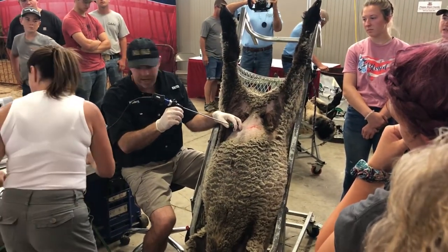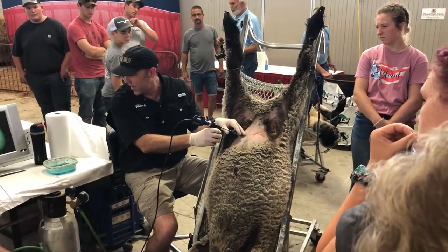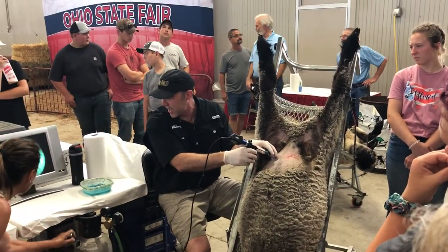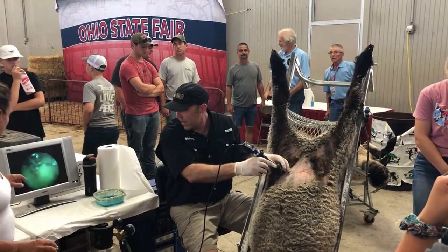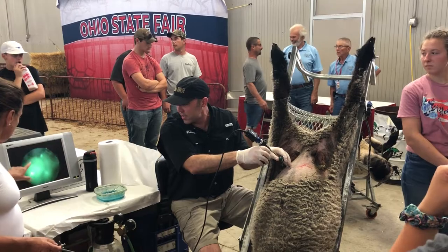It's not going to be a great view in here, but hopefully it gives you a little bit of an idea of what we're trying to see inside. I wish this TV was a little better, but okay. So there's the horns up at the top.